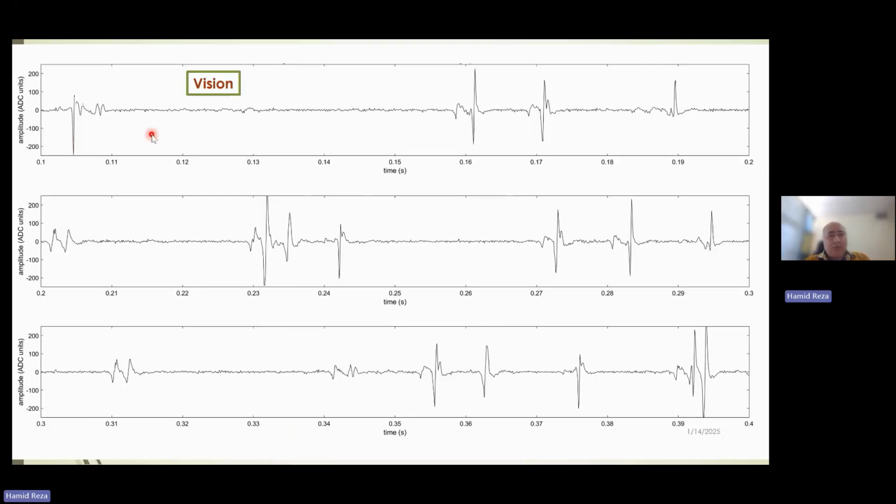So they tune the needle based on the feedback they have to be able to pick up the highest signal to noise ratio and in the best possible place, along with the standards that exist in clinical practice. So suppose that we recorded a good signal, okay? A good signal in terms of SNR and electrode location, and now you would like to decompose it. And now suppose that you would like to do it manually. I talk about it from the manual point of view, and then we automate it through template matching.